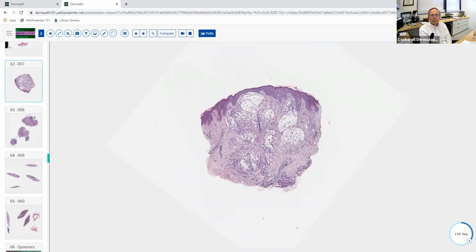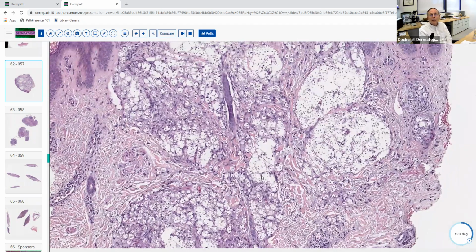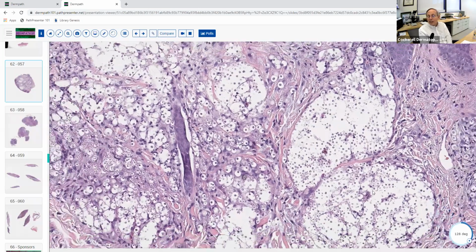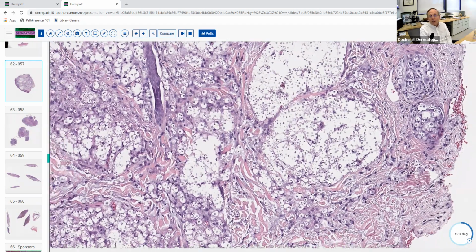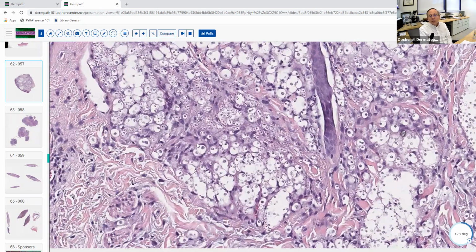So this is clearly abnormal. So is it a neoplasm or inflammatory? We're not 100% sure yet, but let's go to higher magnification. And whoa, we get down here, and what do we see? We see all of these little small organisms floating what looks like freely, again, like in a sea of mucin. So we had the previous example of the mucinous carcinoma of eccrine glands, where you have the neoplastic cells floating freely in mucin. Well, here you have organisms with tons of mucin, a mucogelatinous capsule that is surrounding these organisms.